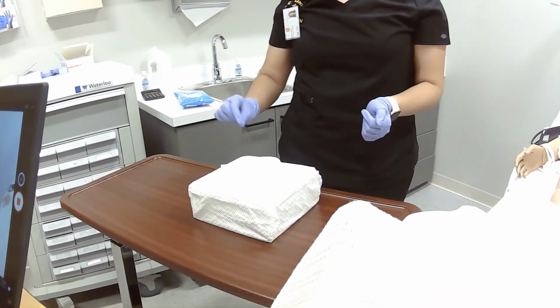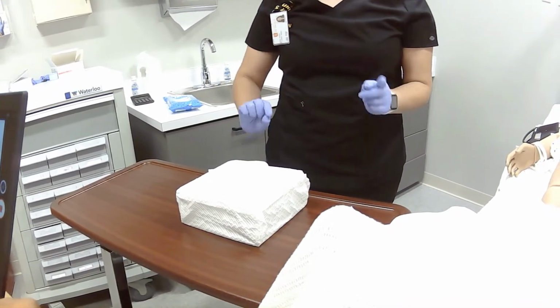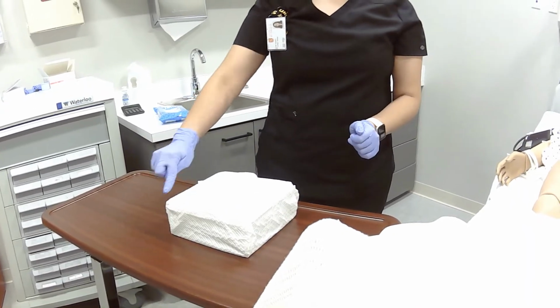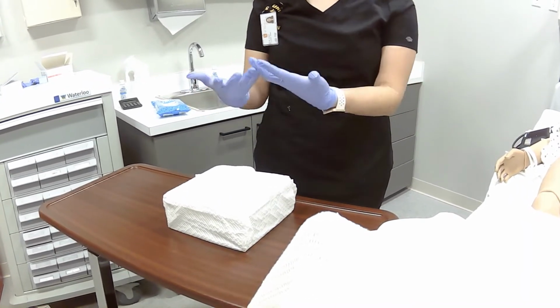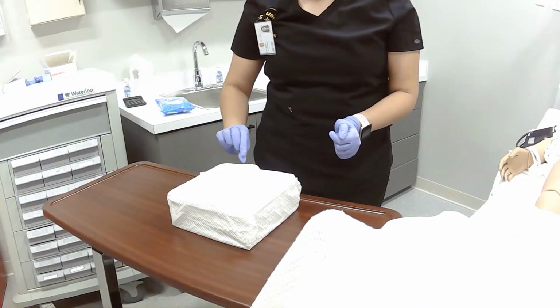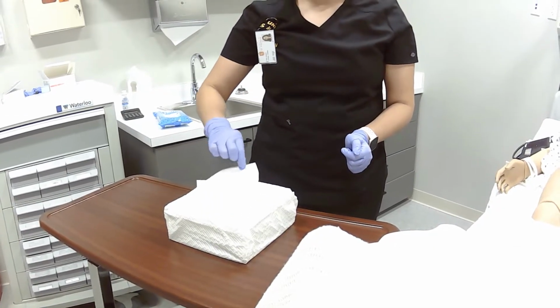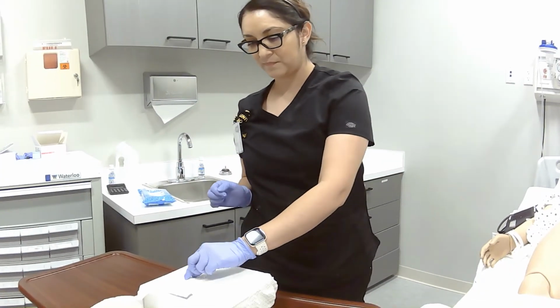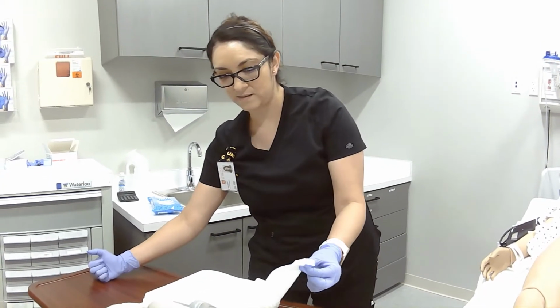okay? So I'm gonna touch just the 1-inch margin to make sure that I am not contaminating inside the sterile drape, okay? So I'm opening it away to the side.